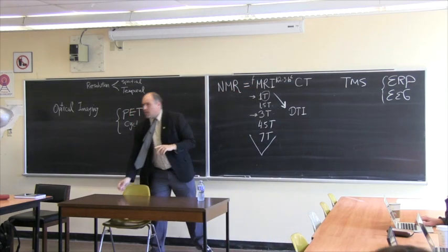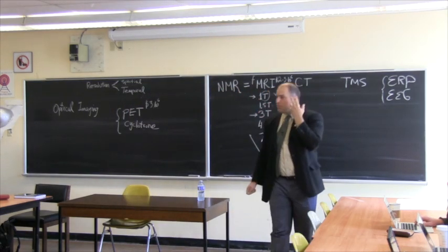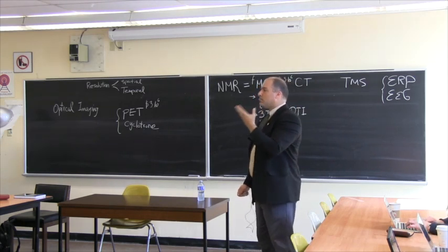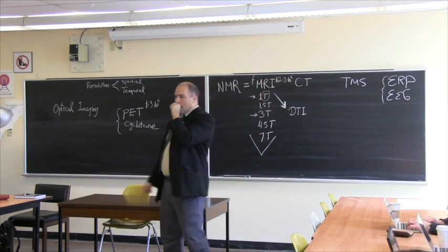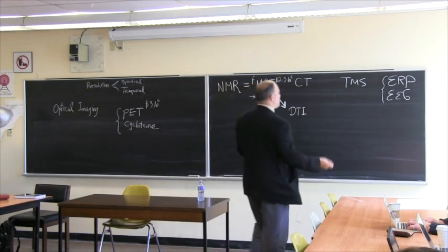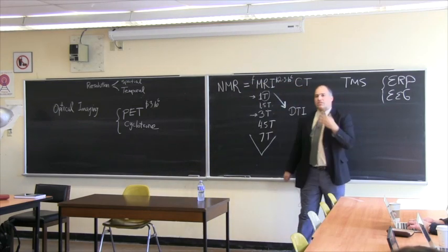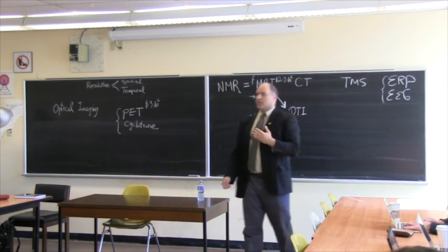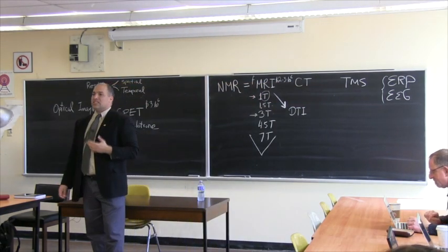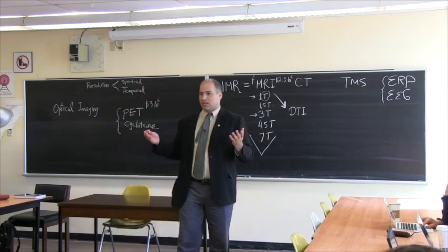So today, at the beginning, we took all these electrodes, we put them on the head, and we eavesdropped on the collection of electrical activity that emerges. And that cacophony, when it's happening spontaneously, is called EEG. If you just put electrodes on the head and you're just listening to what's happening spontaneously, that's just EEG. And that EEG is actually indicative, or somewhat indicative, of some kind of a mode of activity or baseline mode.